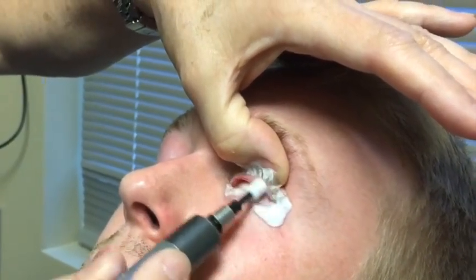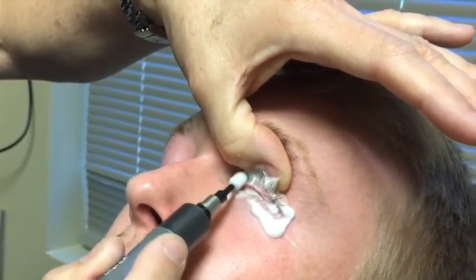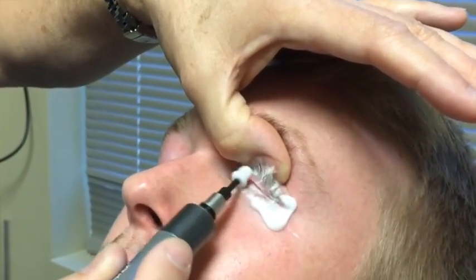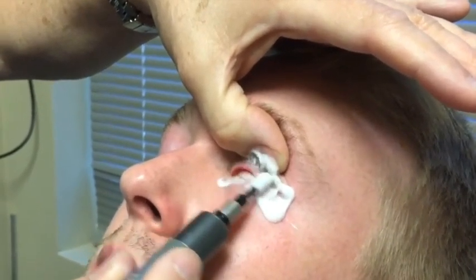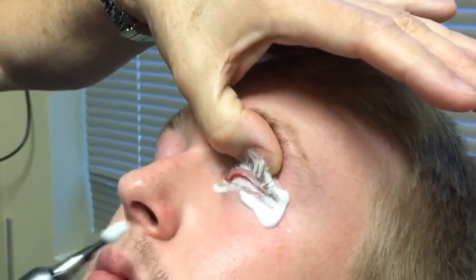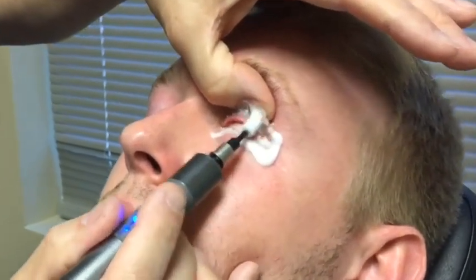Keep popping it out there. Make sure you get those meibomians nice and unroofed, nice and clean, so that diseased meibum mixed with biofilm, I like to call it meibofilm, can start expressing itself. It can slowly start working its way out. Now we're going to reverse. Same thing. Maintain my exposure.